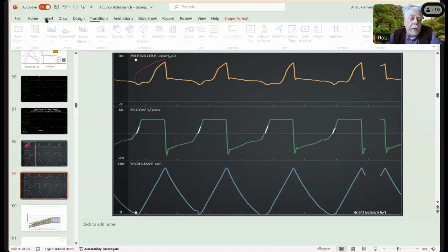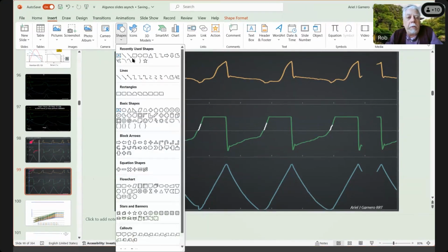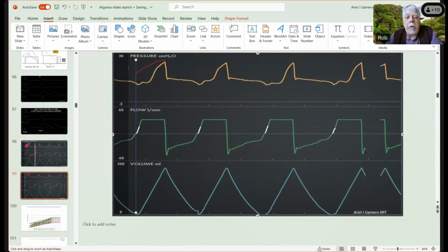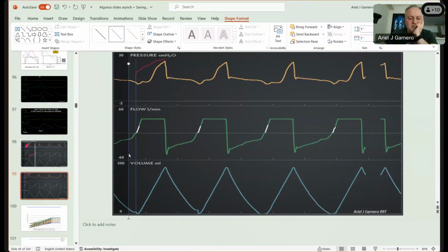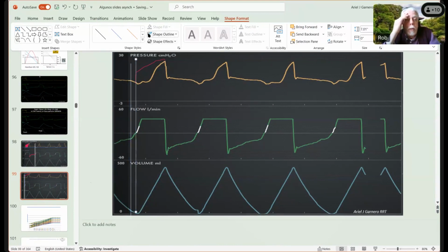So in this patient, if their respiratory drive was reliable, there's no reason why you couldn't go on pressure support, or maybe something, since they are on a Servo, just put them in auto mode, right? Yes, so that would be our solution, I think, Ari, to put this patient on auto mode so that they could get spontaneous breaths if they wanted them. The timing would be more synchronous with their PMUS. And if they got tired out or something else happened, then the mandatory breaths would kick in.